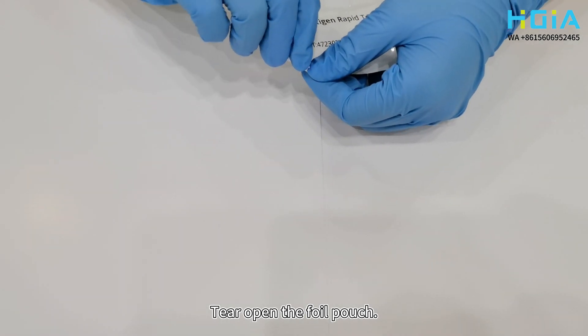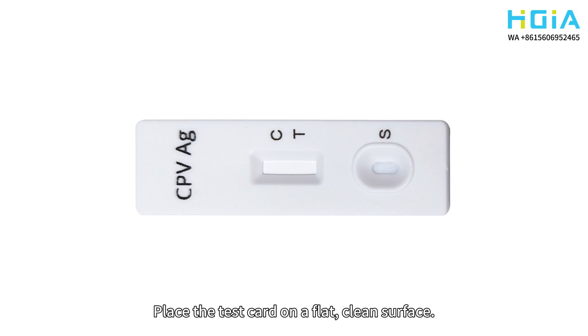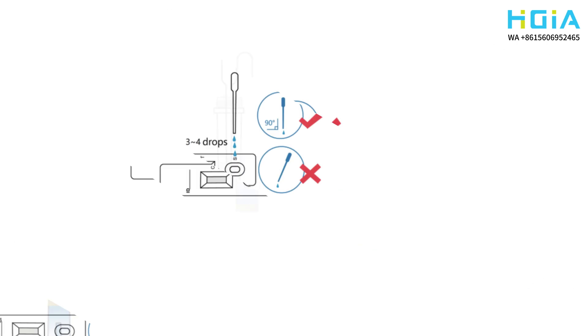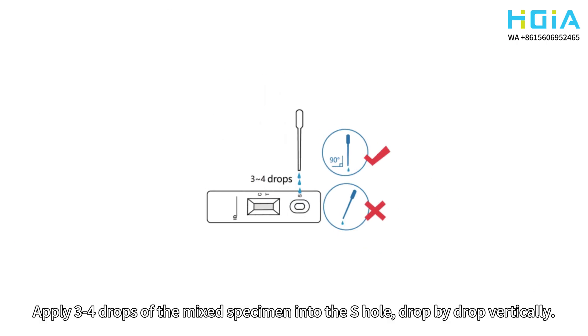Tear open the foil pouch and place the test card on a flat, clean surface. Use the dropper to extract the clear liquid from the tube. Apply 3-4 drops of the mixed specimen into the S-hole, drop by drop vertically.